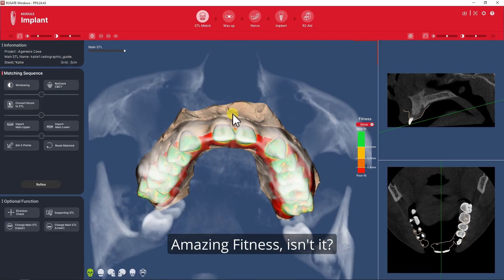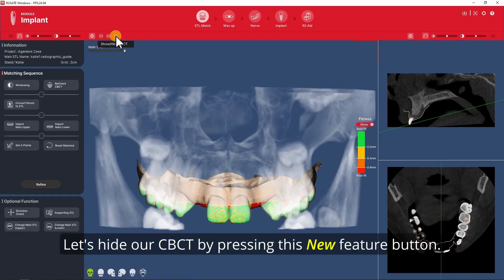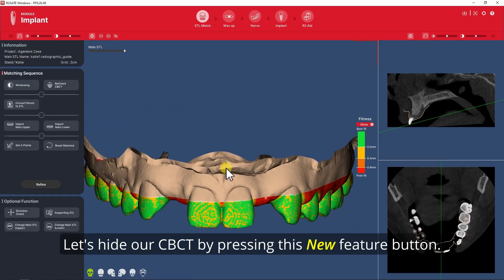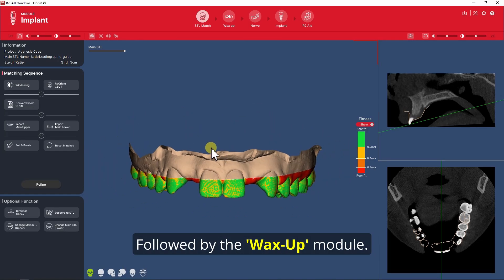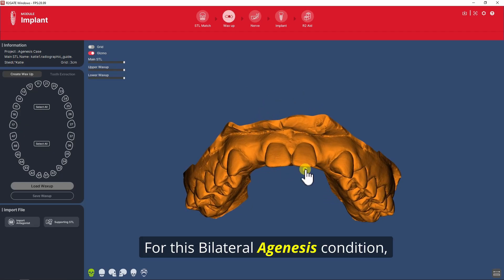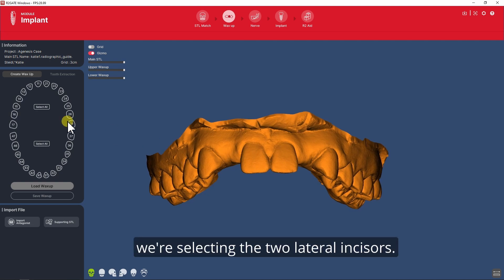Amazing fitness, isn't it? Let's hide our CBCT by pressing this new feature button, followed by the Wax-Up module. For this bilateral agenesis condition, we're selecting the two lateral incisors.